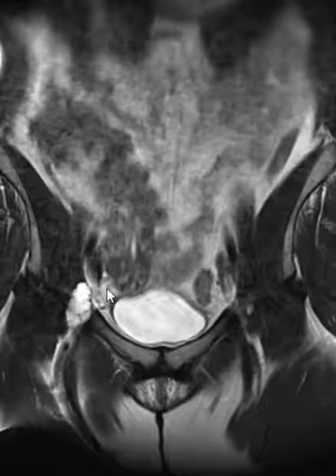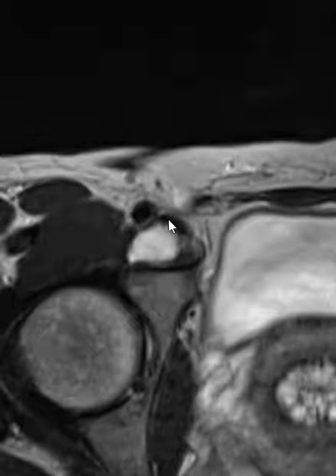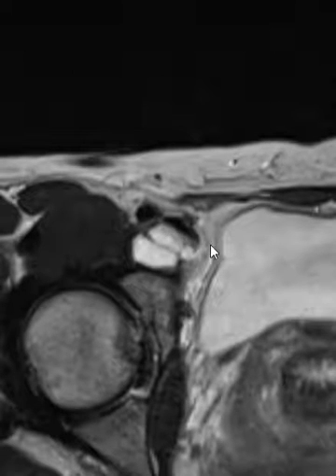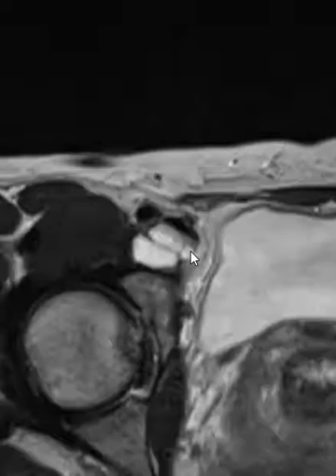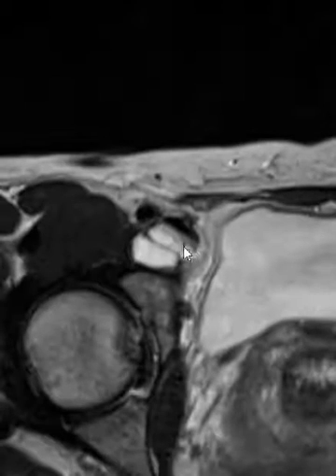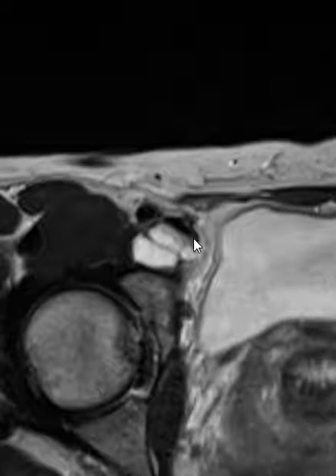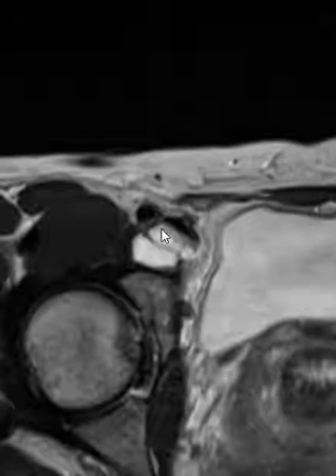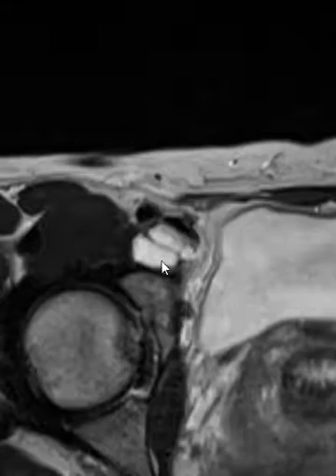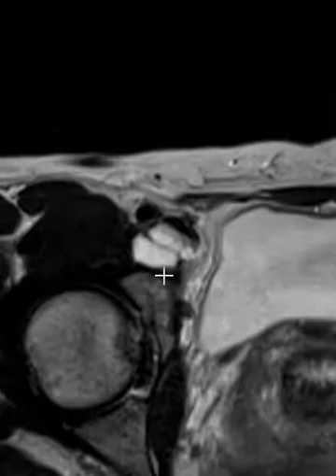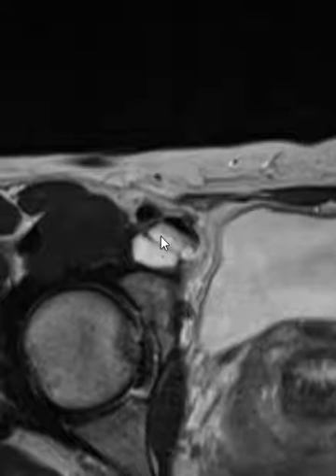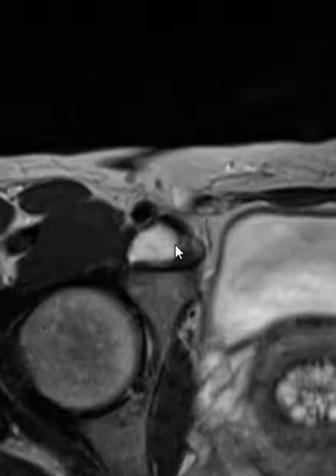This one has such a close approximation with that vein. Here's the artery; there's that vein that's flattened — really it's kind of broadened right there — and then it comes back to a more normal morphology. So this may be cystic adventitial disease of the femoral vein, possibly, or it could come off the artery, but the association is not very obvious there. So if it were that, it would be coming off the vein. And then the other thing is, it still could be some complex ganglion cyst arising from the bursa. In the end, if they're symptomatic, they can go in there and take that out and figure out what it is.